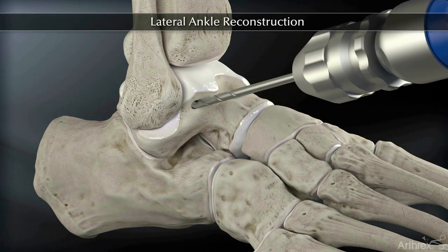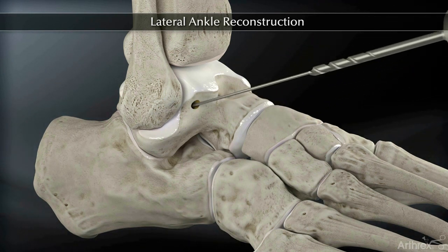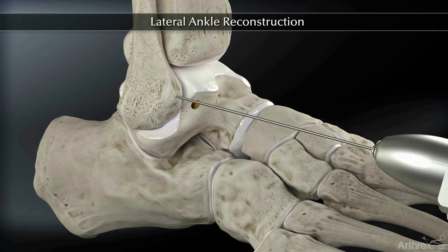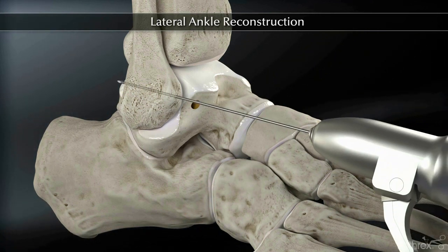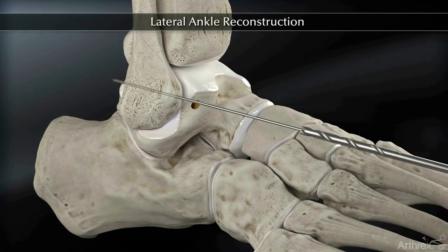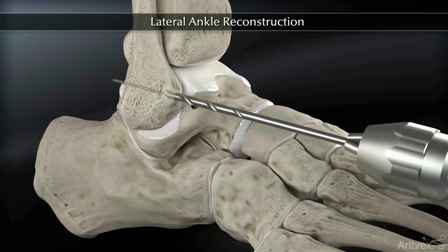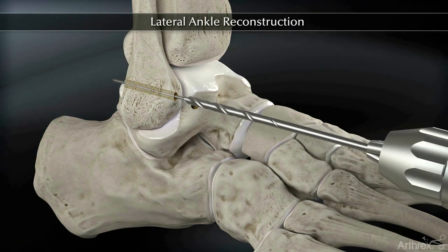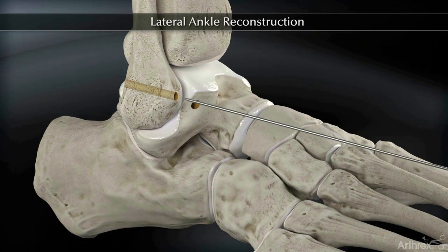After removing the guide wire and drill from the talus, proceed to drill the first of two tunnels in the distal fibula. The first 2.4 mm tenodesis guide wire should be placed 14 mm proximal to the distal tip of the fibula. After placing the drill pin, drill over the guide wire with a 5 mm cannulated drill through both cortices anterior to posterior.